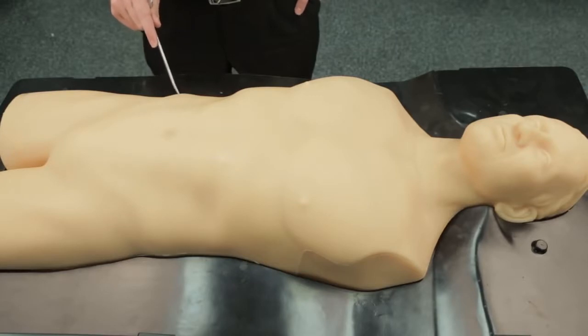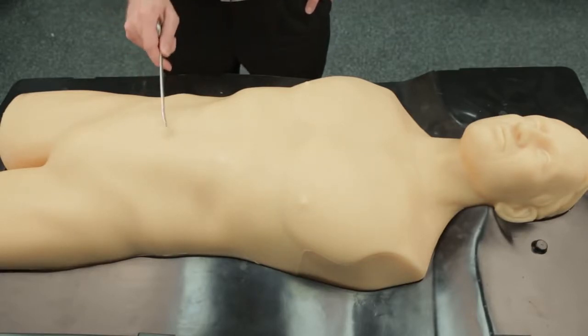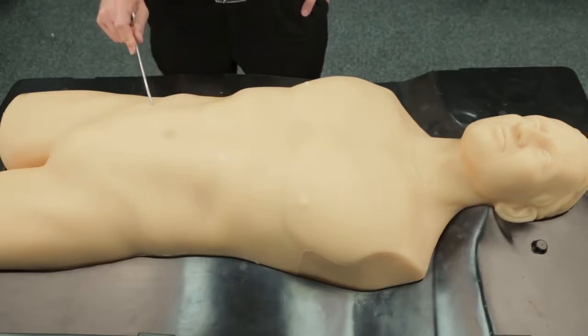A lance incision crosses McBurney's point in the skin crease. A gridiron incision, which is in line with the fibres of external oblique, crosses McBurney's point perpendicular to the spino-umbilical line and may be useful if the incision needs to be extended towards the right upper quadrant.